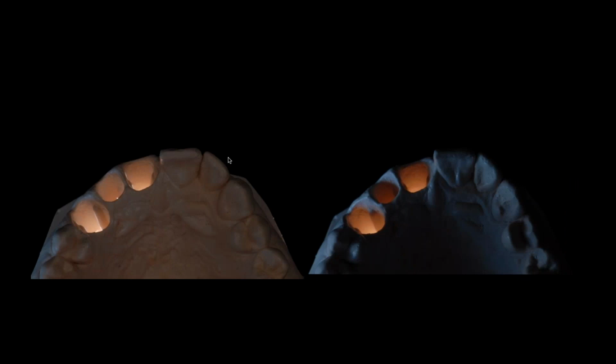And I said to you earlier that the model and die wasn't the most important thing to me, but I do utilize it. But where it has become more important to me is we do work a lot off alveolar casts here, and that's where we have a removable either stone die or refractory die that can come in and out and maintain our soft tissue, especially on our veneer cases.